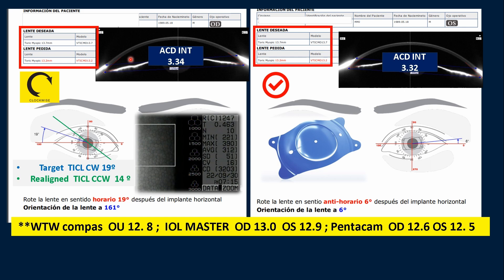Here we have the internal ACD values, and this is the implantation diagram for the right eye. We can see that the ideal axis was 19 degrees clockwise rotation where the lens was placed, but the lens still rotated beyond that — positioning itself 14 degrees further clockwise. Both eyes had very good endothelial cell count.